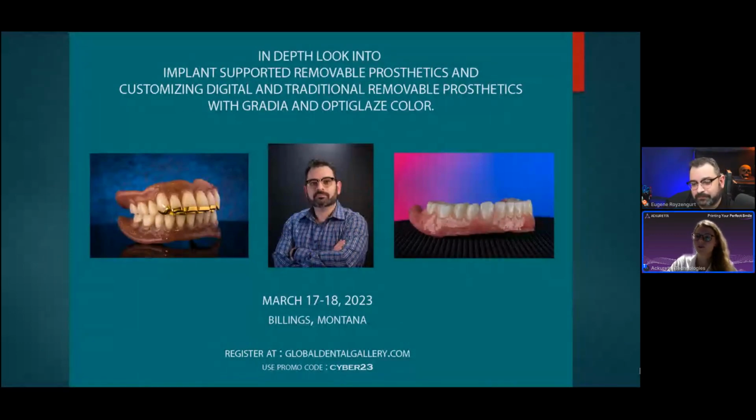Sorry. Yeah, of course. From our side, we try to support everywhere we can and make it as easy as possible. So when you were talking about the VAT film, for example, our recommendation as a company is, of course, to not do that yourself, but rather to purchase the VATs entirely, because it doesn't really make that much of a difference in that case, right? So that's our recommendation, to just purchase multiple VATs and just keep your resin in the vat, stored away, protected from UV light. That's a key thing.